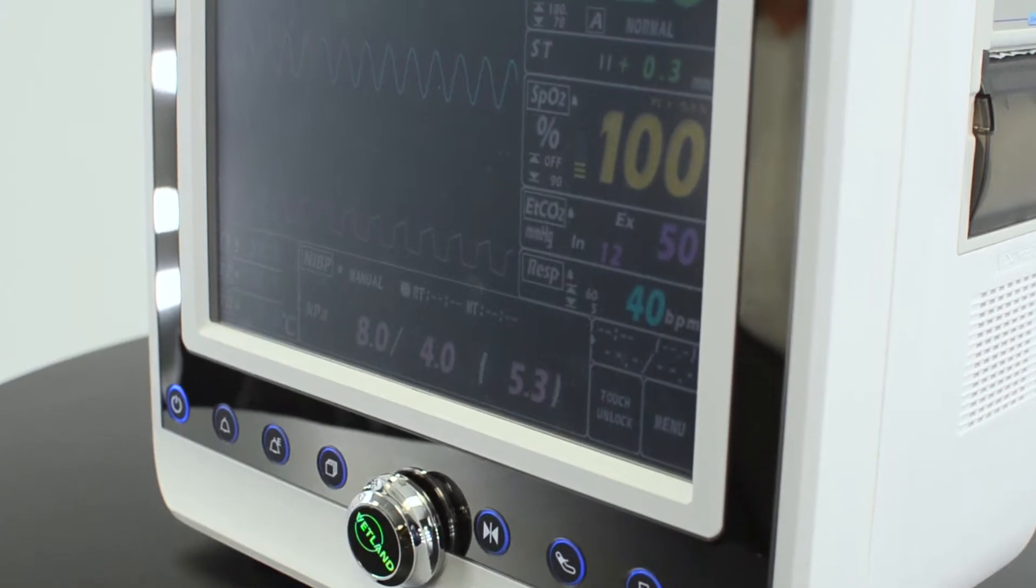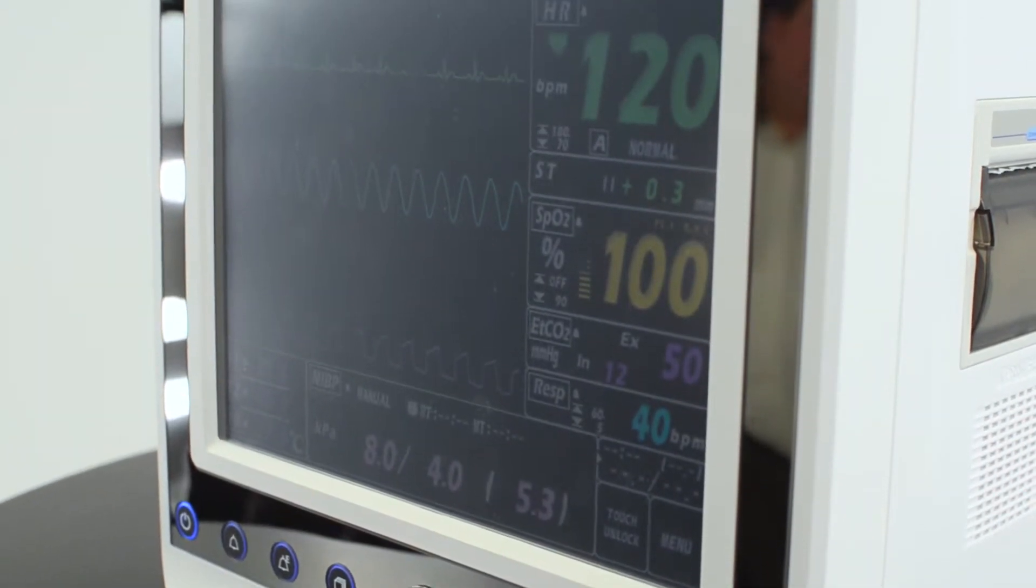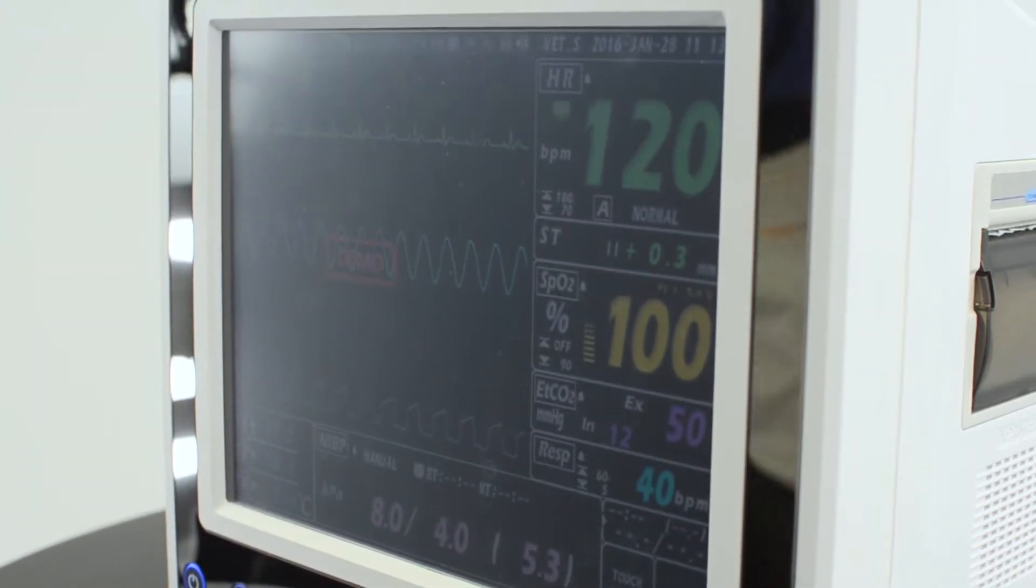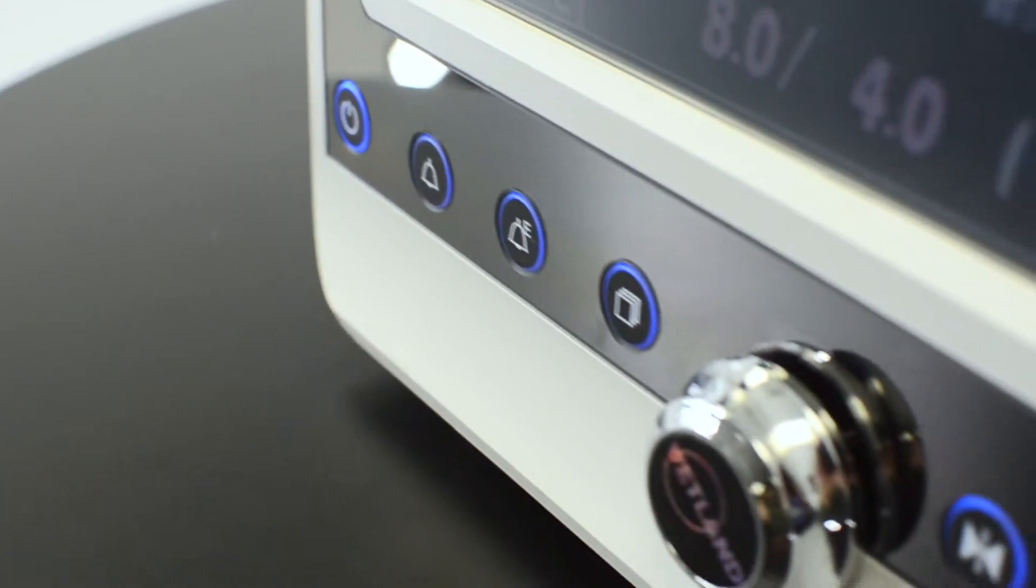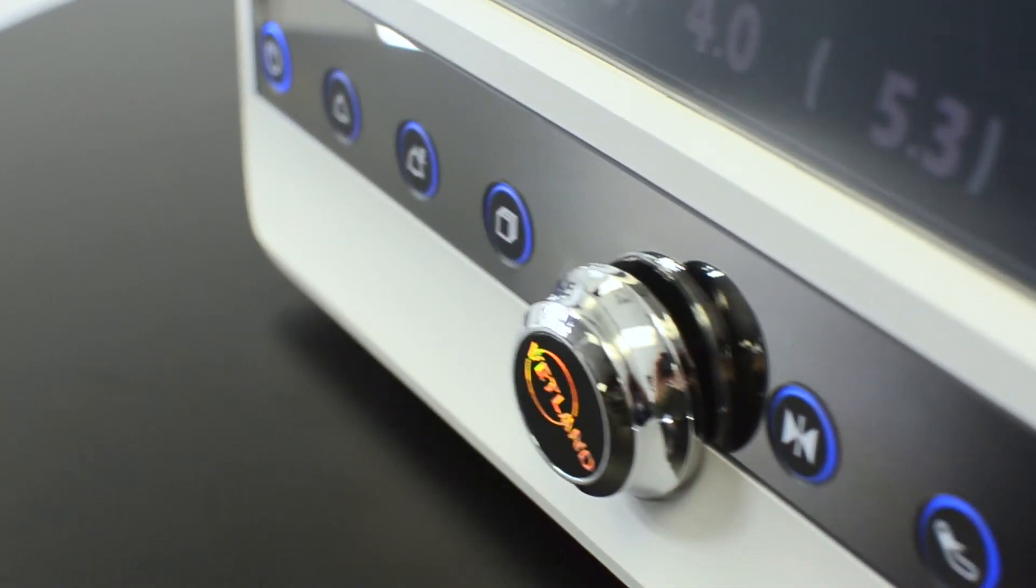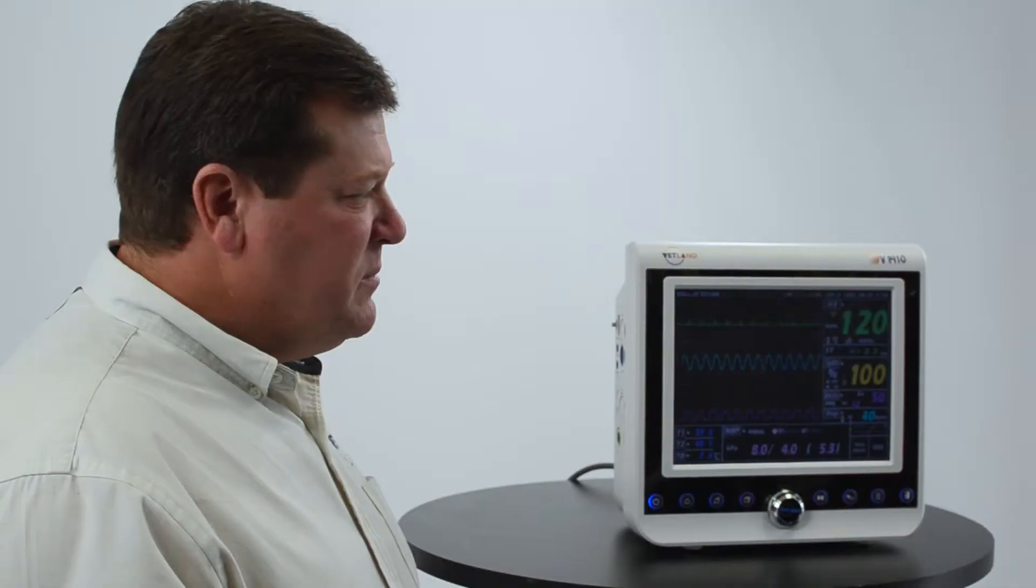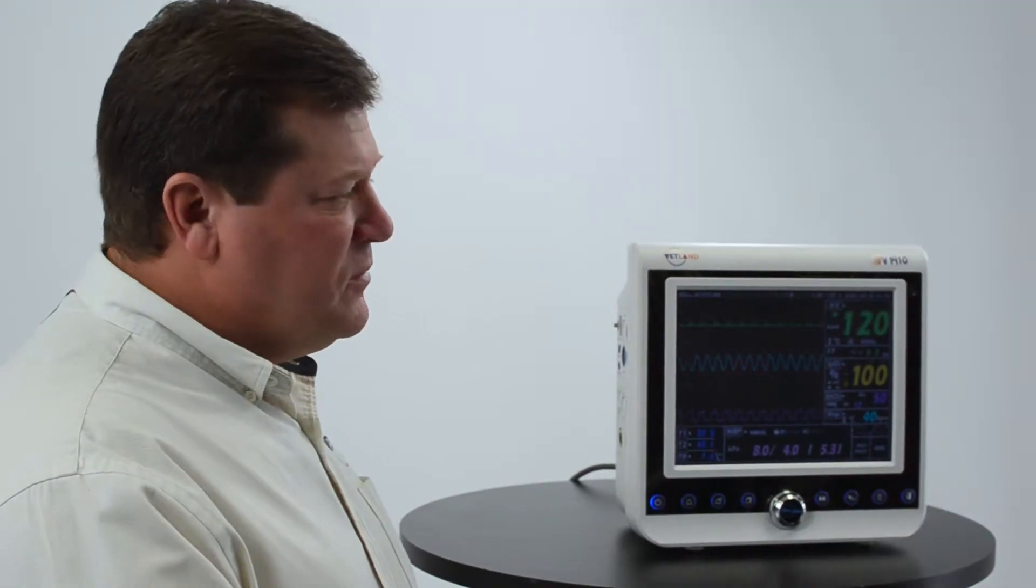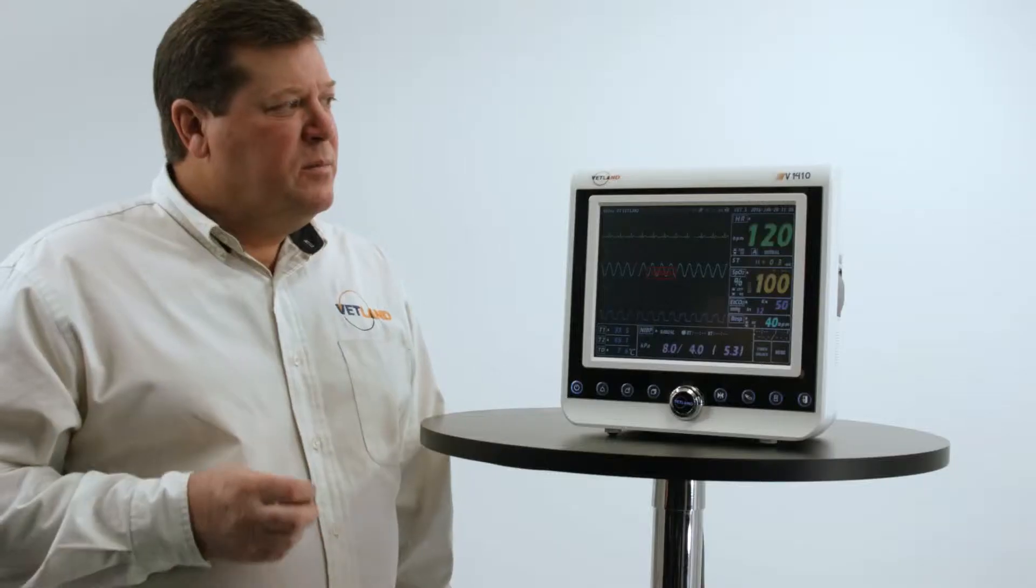We have a 7 inch, 10 inch, and 12 inch monitor. The 1407, 1410, and 1412 denotes the size of the display. They basically all perform the same functions. It's just a matter of display size.